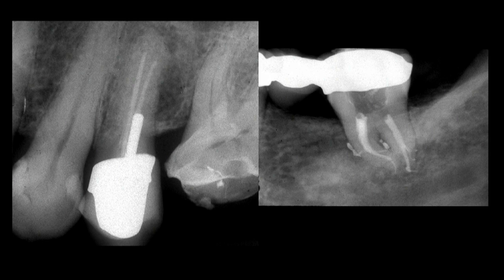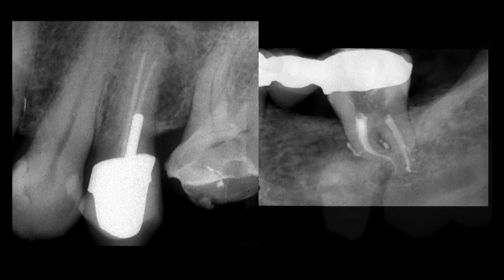If we look at this retreatment patient, the post is removed, the gutta percha removed, we discover the missed apical anatomy, we shape it, we pack it.